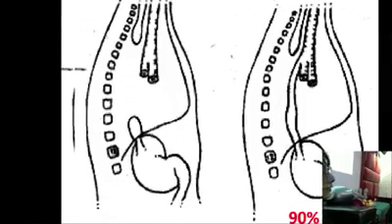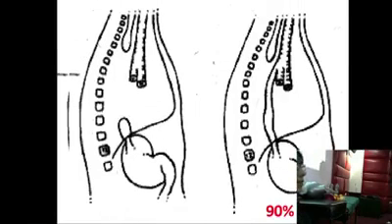The problem that you are going to face now, in what way would we detect there is esophageal atresia? Because in most cases you don't see the esophagus so well in the fetus. Right? So we cannot just go and see and say that, oh no, the esophagus is not seen, so this is esophageal atresia. We get indirect clues. What can be the indirect clues? Whenever there is esophageal atresia, what will happen? The baby would not be able to swallow fluid.